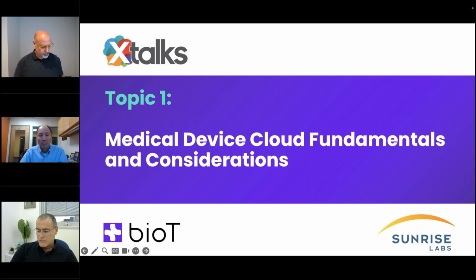Basically, through the cloud, they engage with patients, asking them questions about how they felt before the treatment and after the treatment. They've built one of the largest databases in the world for understanding why migraines happen. And through that, they are able to introduce new features and new capabilities, which are more optimized to specific patients and improve patient outcomes. And there are more and more examples around that, data sharing capabilities and so on around the cloud. I guess we won't have time to get into all of those details today.